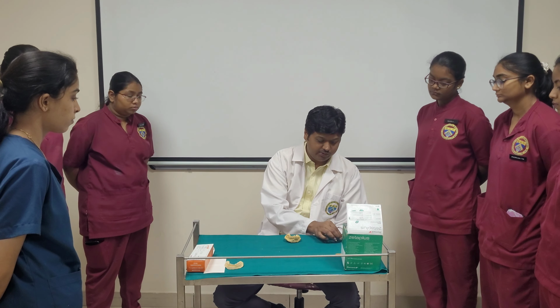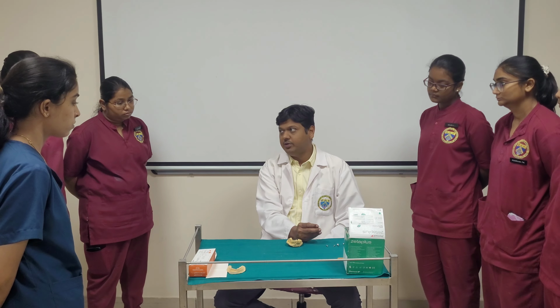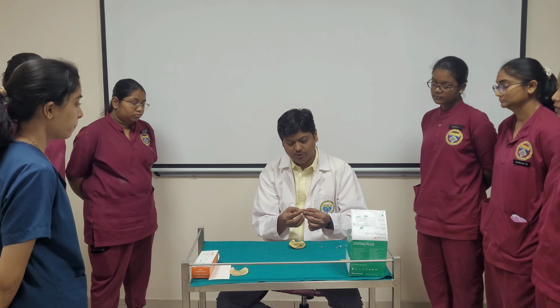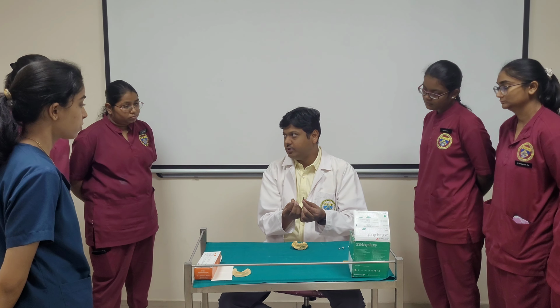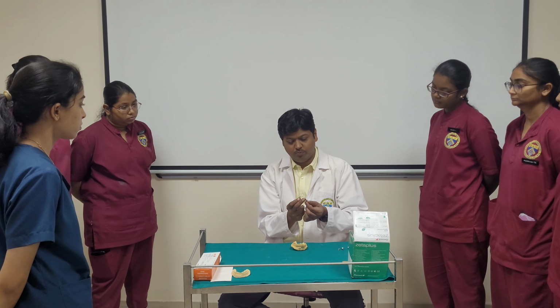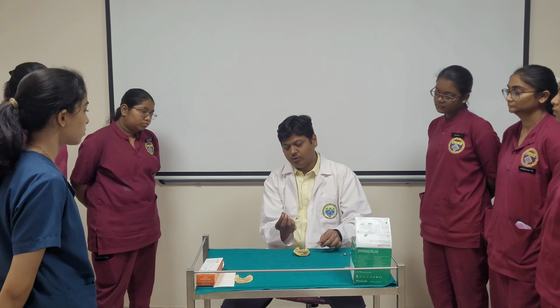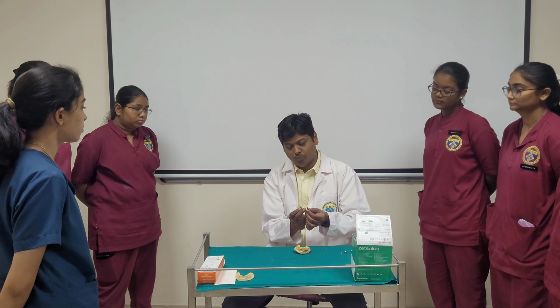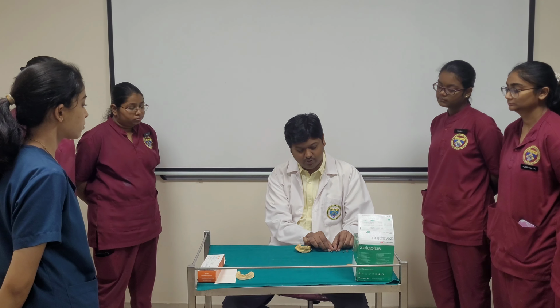and we will place something called as impression post or transfer coping inside the patient mouth. So there are two types of transfer coping. One is open tray transfer coping, the other one is closed tray transfer coping. You can see the screw in the open tray transfer coping is bit longer compared to the screw in your closed tray transfer coping, the screw is in flush with the head, whereas in your open tray the screw is slightly extended. Why? The difference between open tray and closed tray, I will tell you.